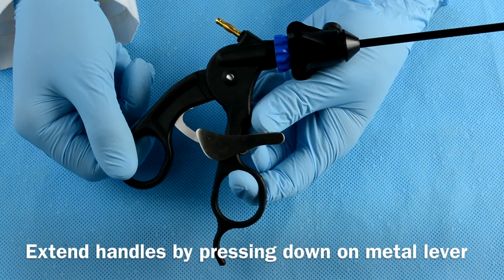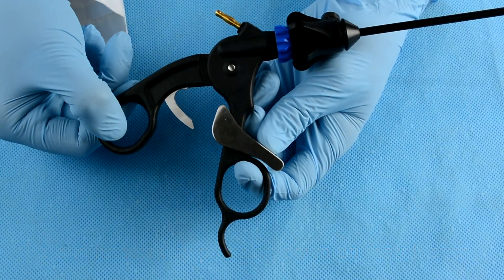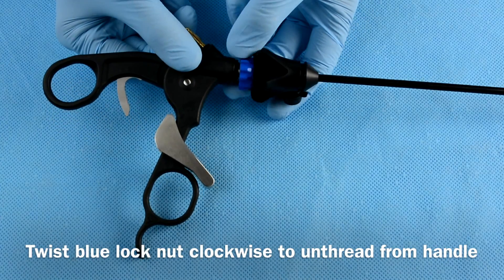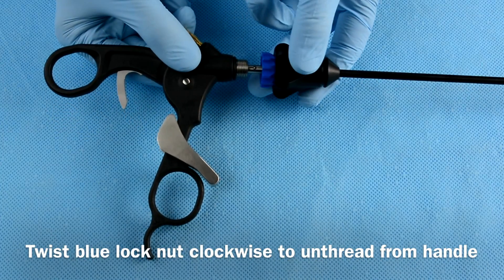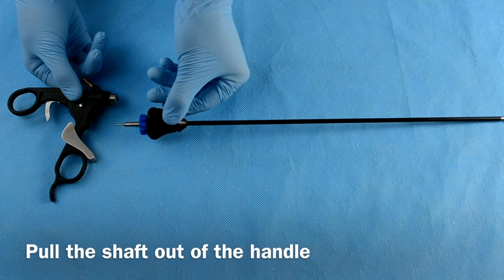To disassemble, press down on the metal lever to fully extend the handles. Twist the blue lock nut clockwise to unthread the shaft from the handle. Then take the shaft out of the handle.